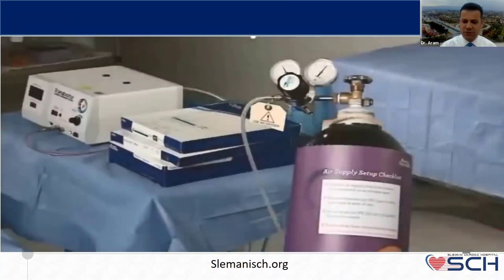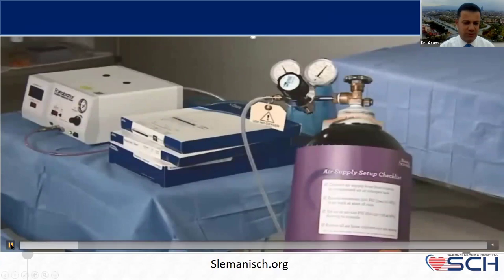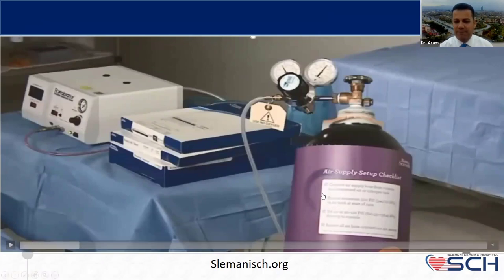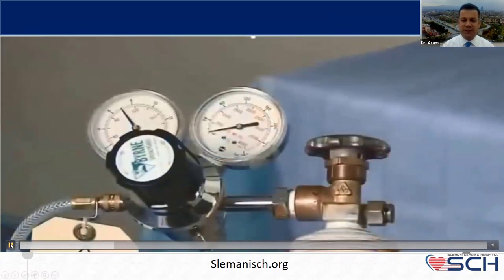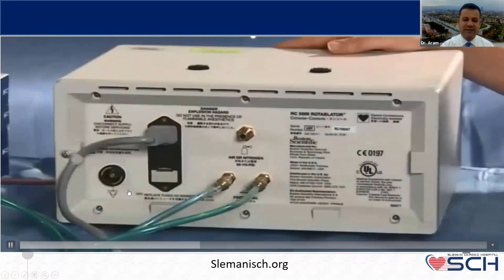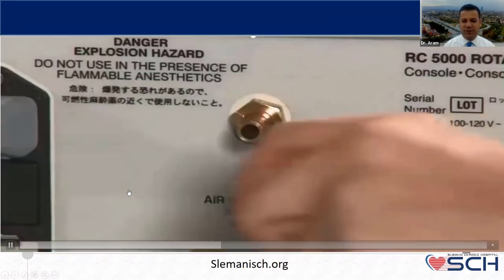Even Dr. Amjad can help me in these videos, just to prepare your system. This is the gas tank, attached to this special instrument, and this is a valve. The gas is attached to the console.